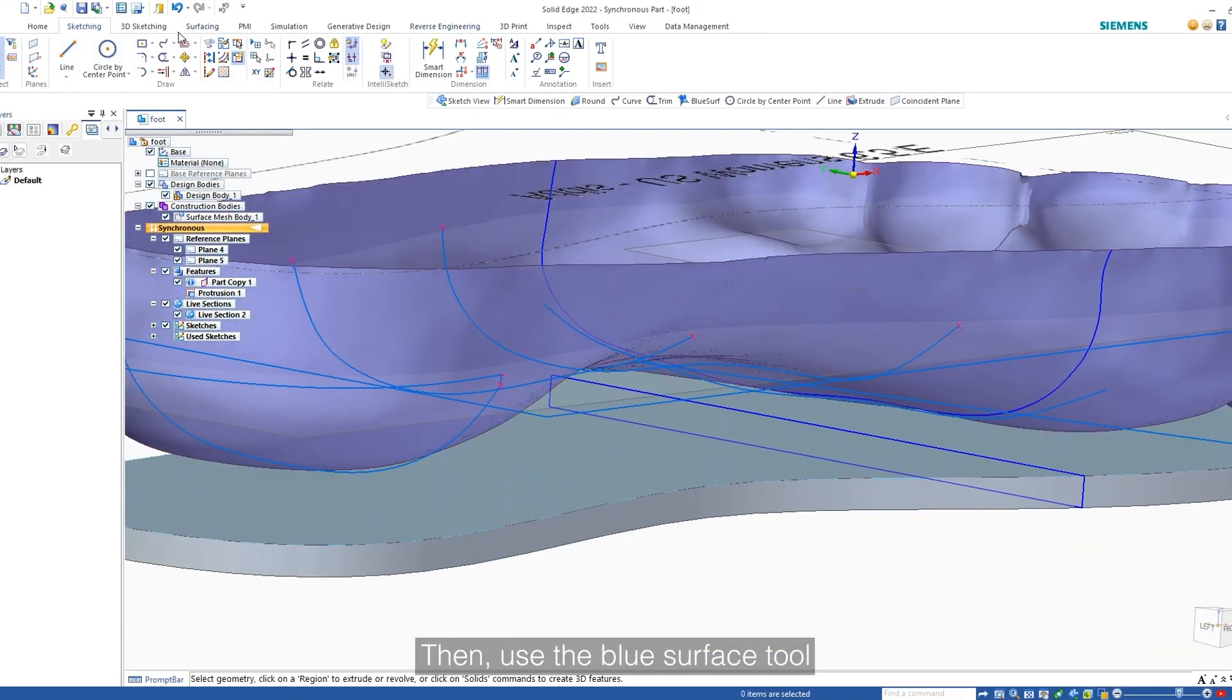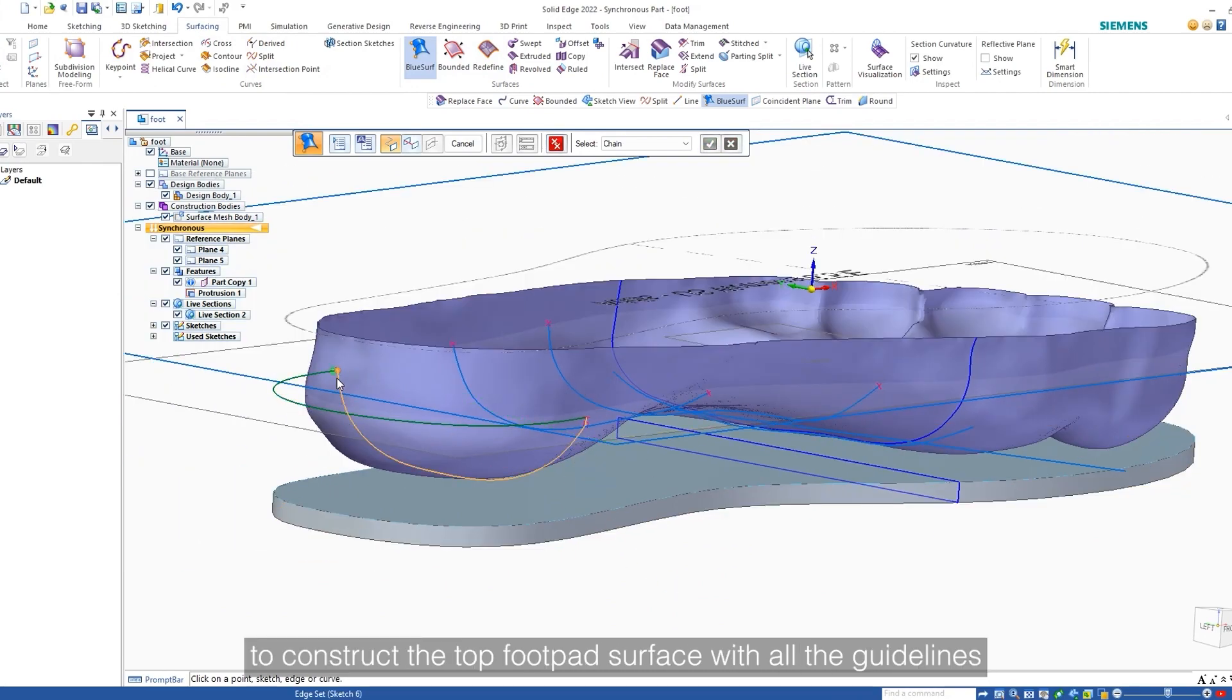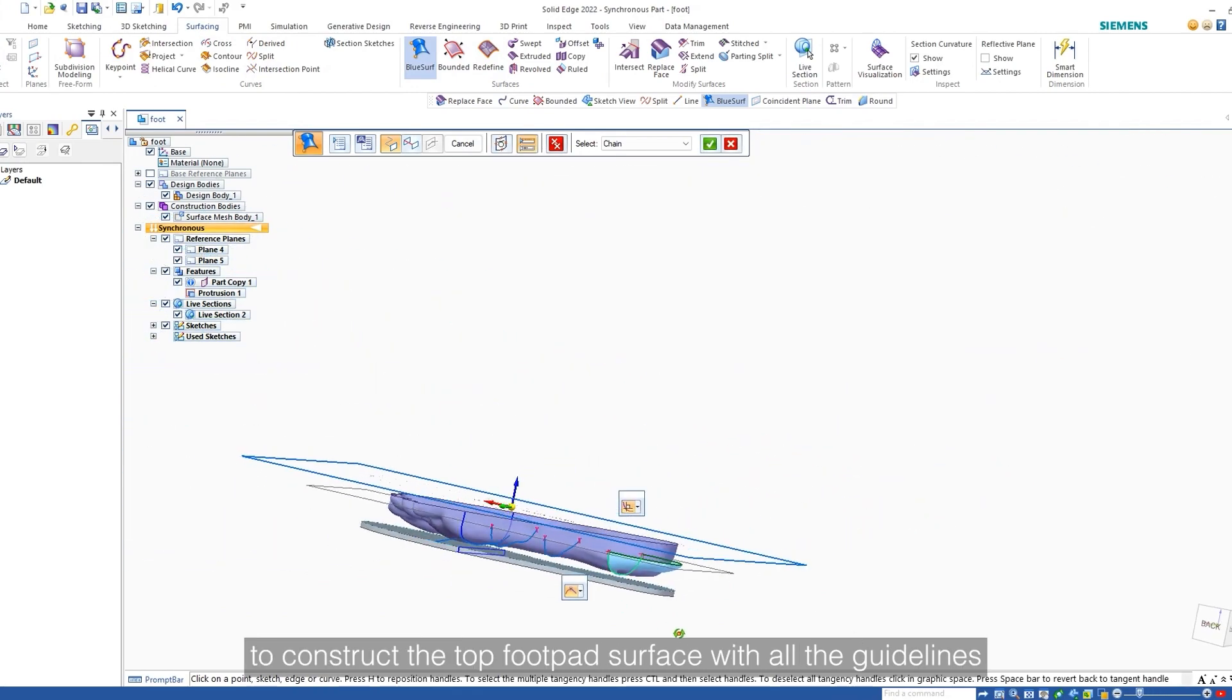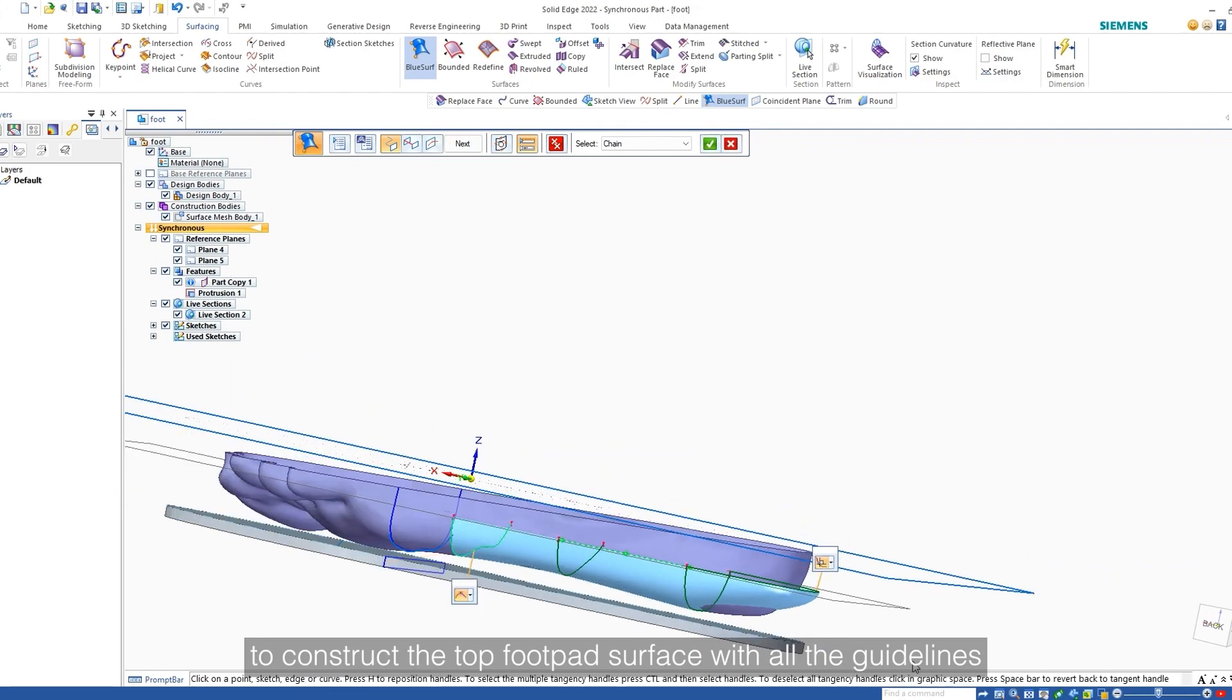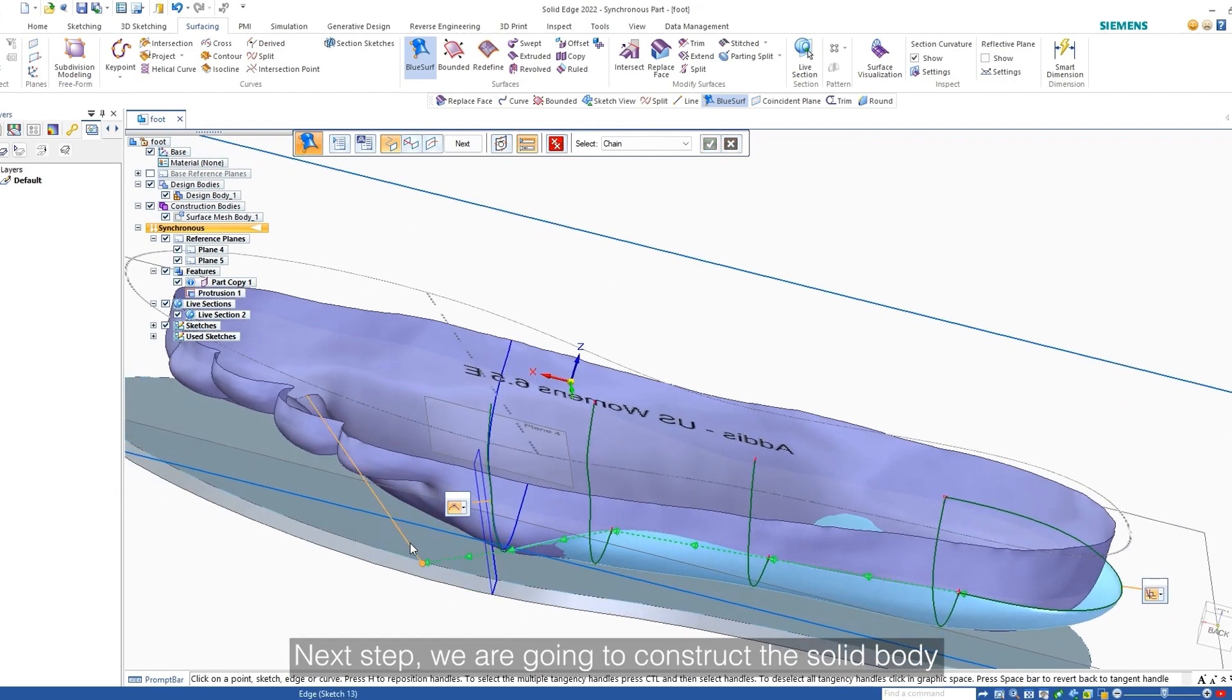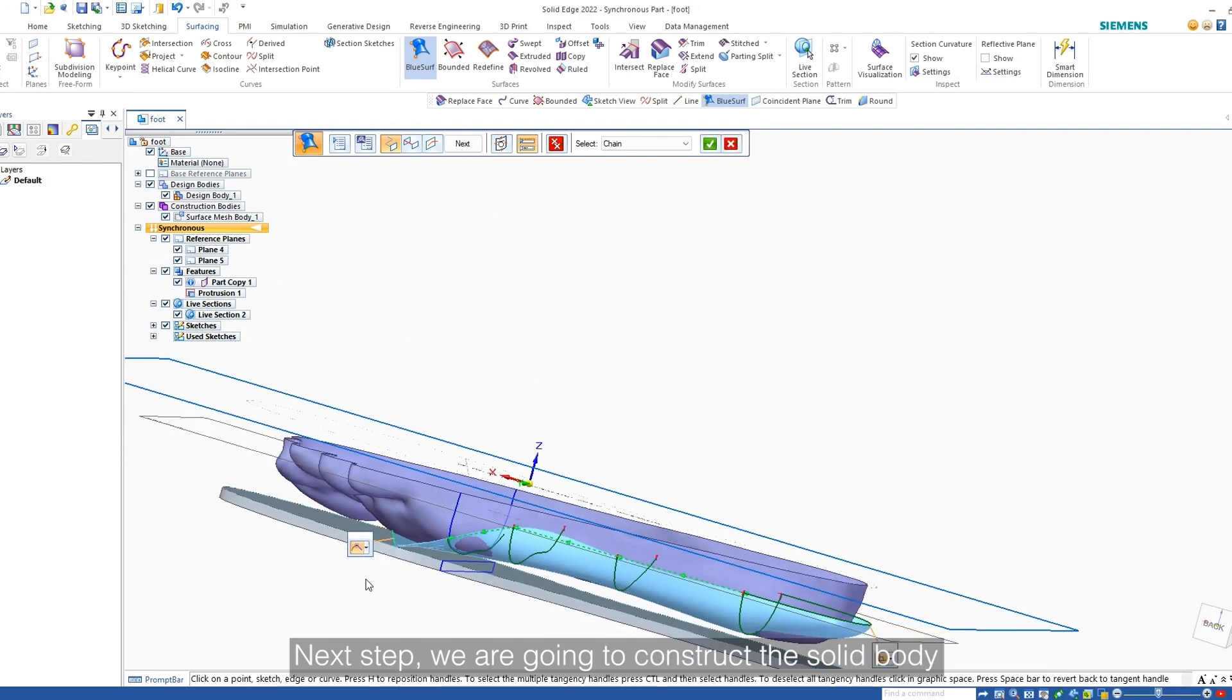Then, use the blue surface tool to construct the top foot pad surface with all the guidelines. Next step, we are going to construct the solid body.